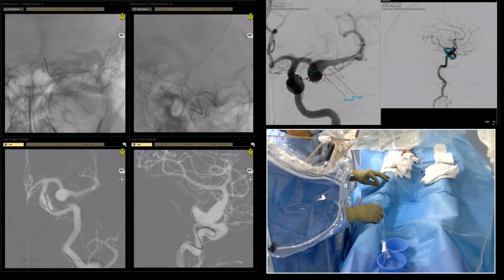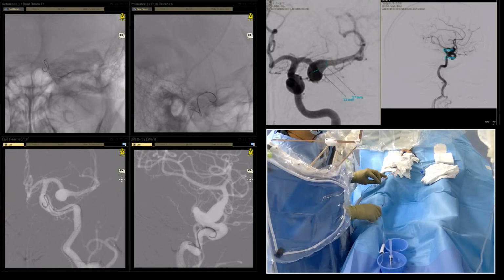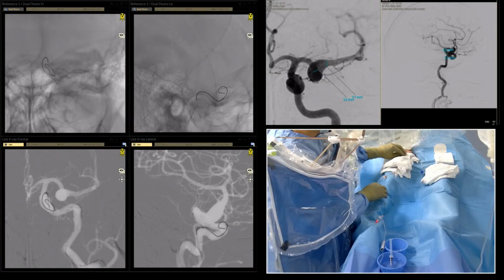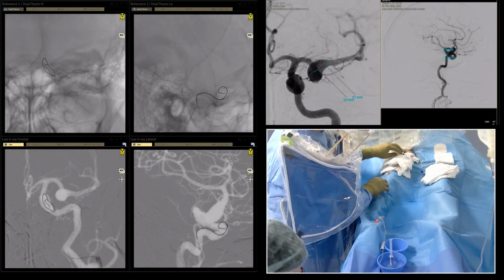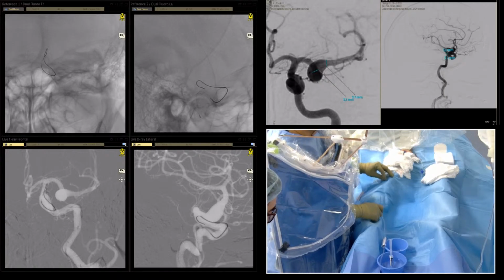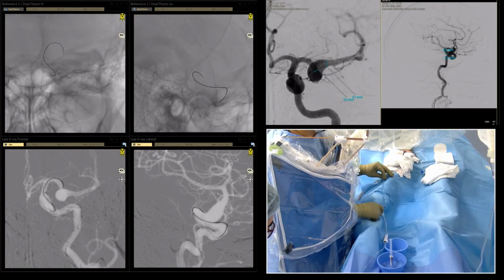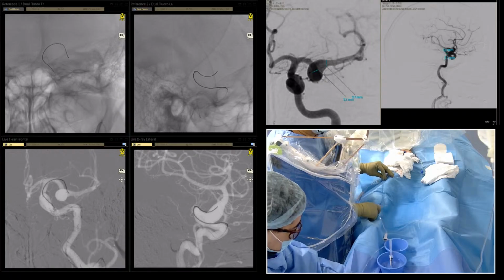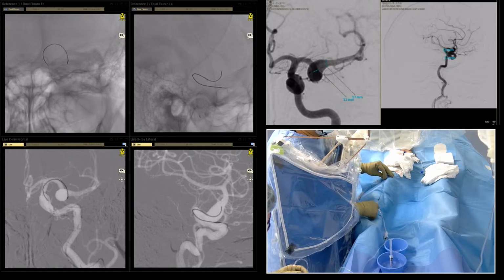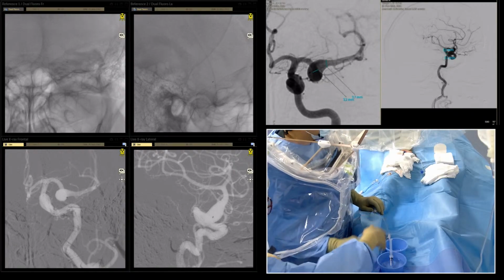3.25. The device is quite stiff, huh? Basically like this.